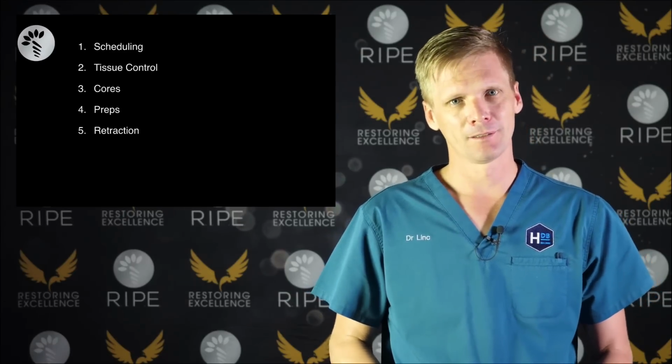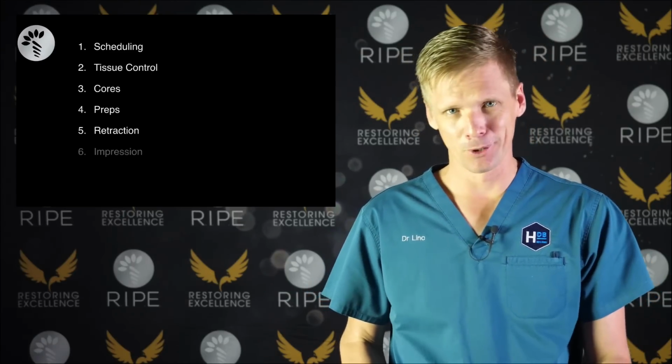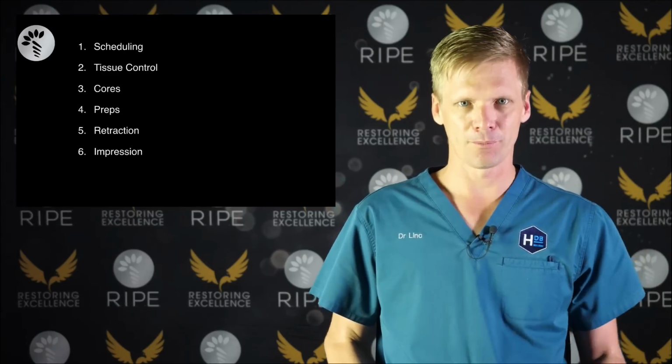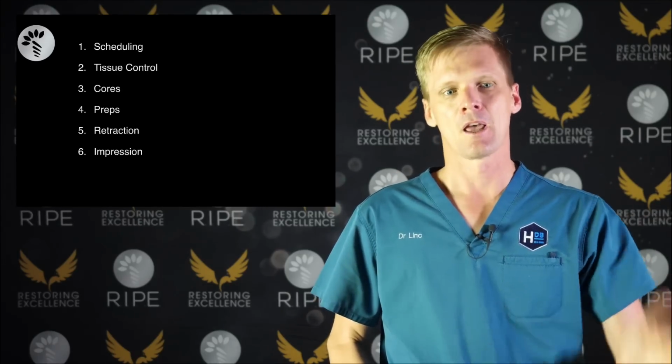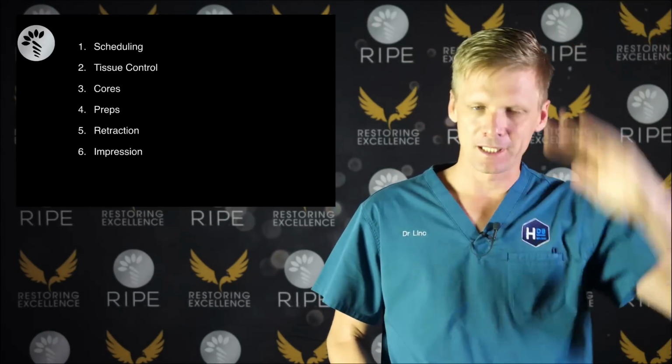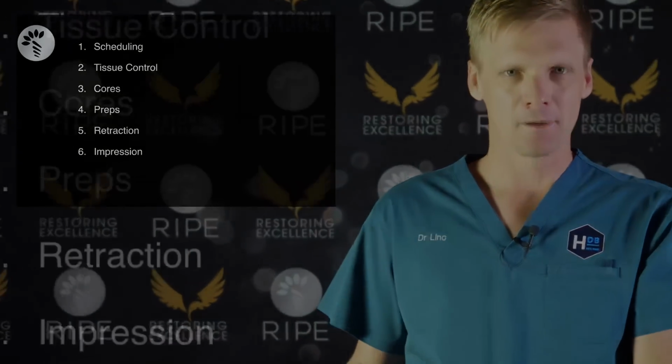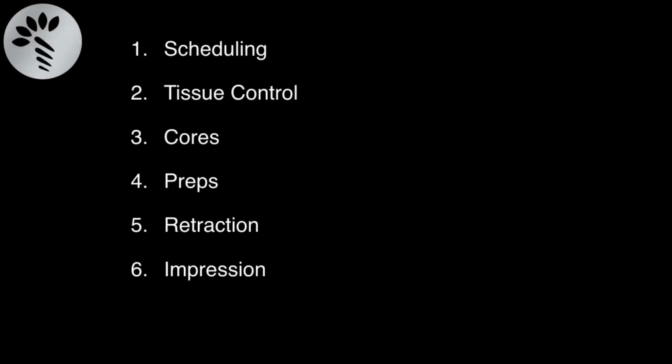And the last one is the impression. That's probably the least important. So the least important part of getting a good impression is the actual impression material, trays and all that sort of thing. The most important part is the 5 steps that come before that, but we tend to focus on the 6th one, and that's why we often get bubbles, we get drags, we get missed impressions and so on, okay? So let's talk about scheduling.